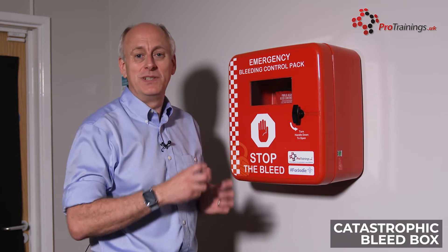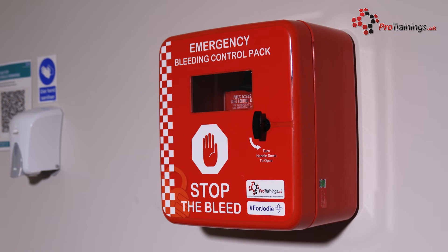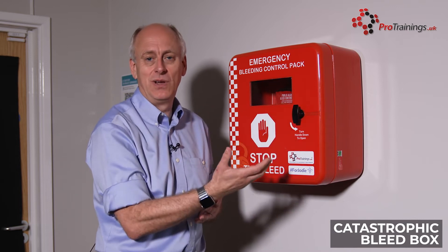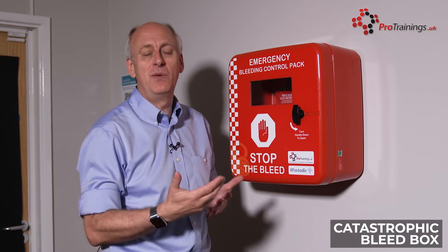This is a catastrophic bleed box, which is very similar to an external AED box. This particular box is available as an internal version like this one, with just a standard lock on it, or you can have an external version with buttons, which can be given a code by the emergency services or certain people who need to know it.